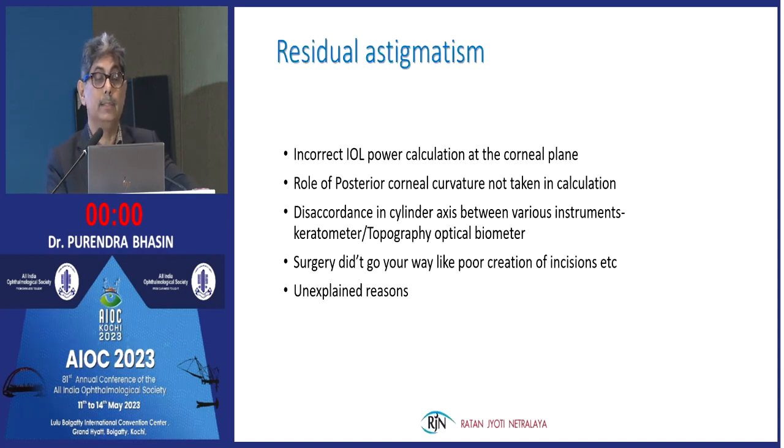Now, coming to the residual astigmatism, which could be due to incorrect IOL power calculation, or we have not taken into consideration the posterior corneal curvature, or there is a disaccordance in the cylindrical axis between various instruments, and still we have gone further without checking it again.